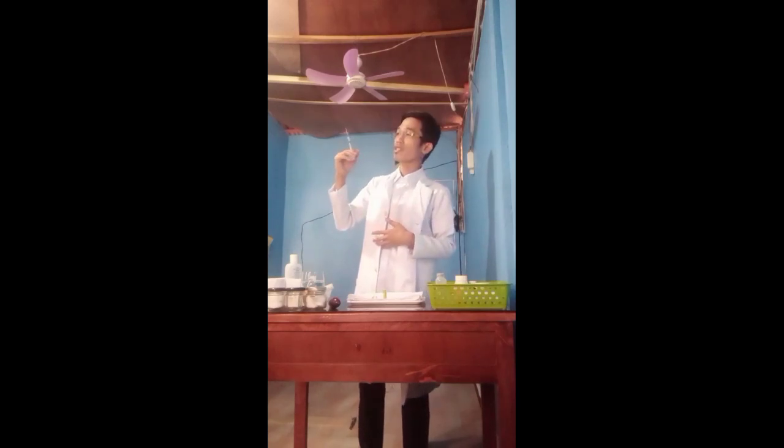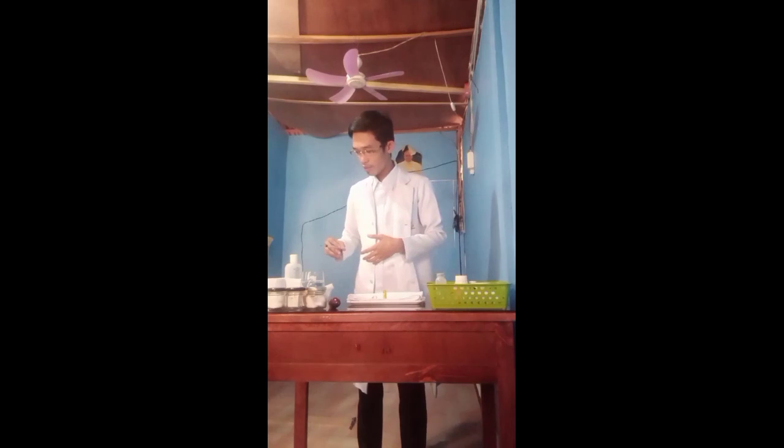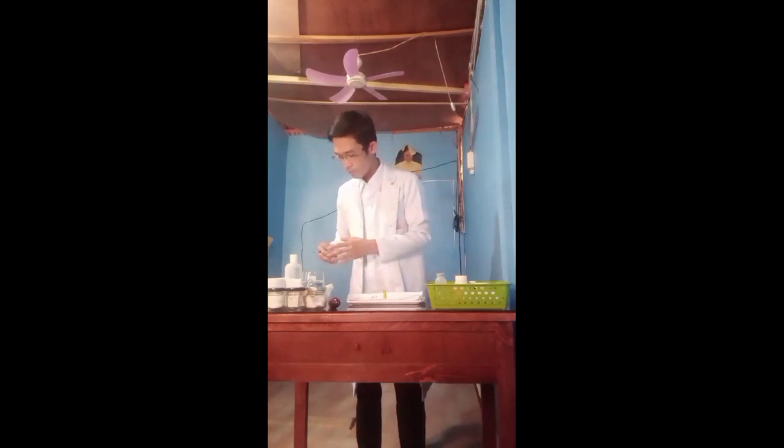So if you think that the medicine you are putting in the syringe is too much, if you are going to reduce it, put it in the sink, by doing the vertical level, just like this. Okay.